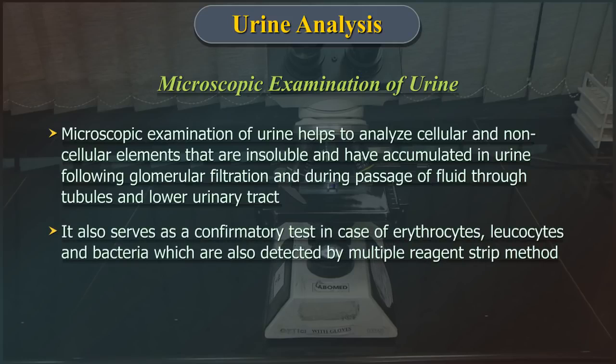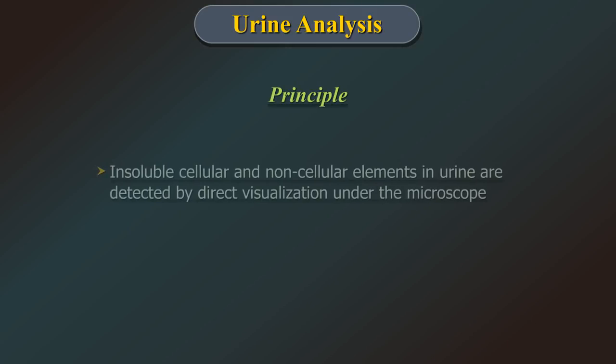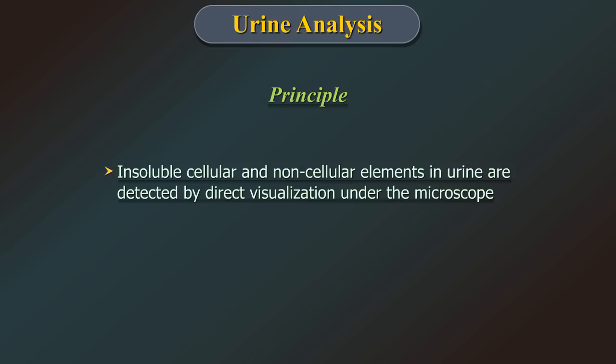It also serves as a confirmatory test in case of erythrocytes, leukocytes, and bacteria, which are also detected by the multiple reagent strip method.